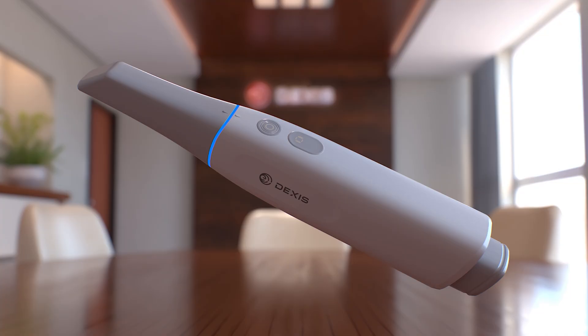Blue: scanner is active and battery level is strong. Amber: scanner is active but battery is running low. Cyan: genius control mode is engaged. Green: scanning is in progress. Yellow: scan tracking is momentarily lost. Dark: power is off.